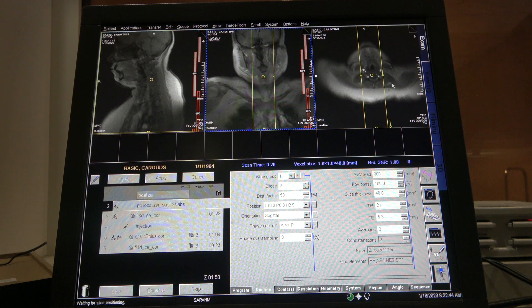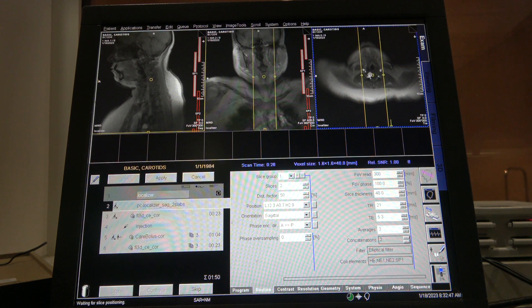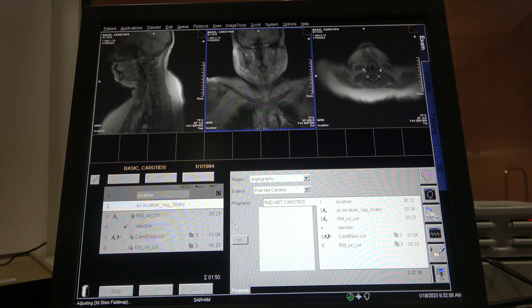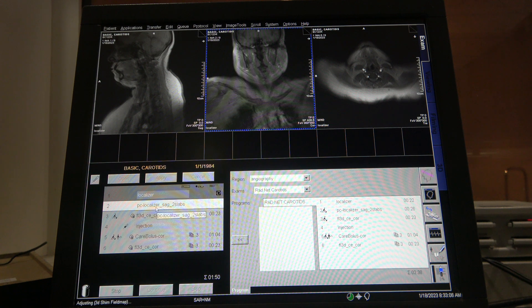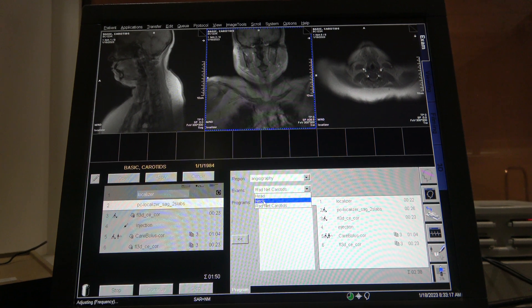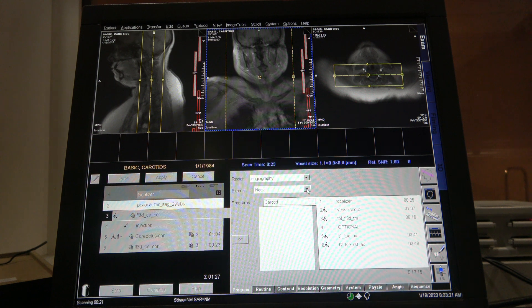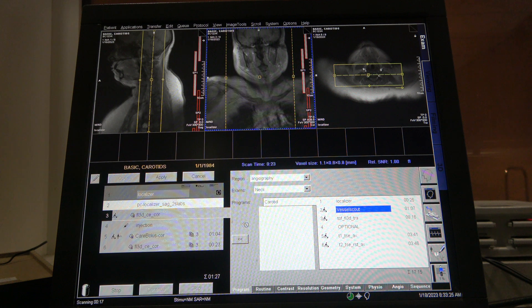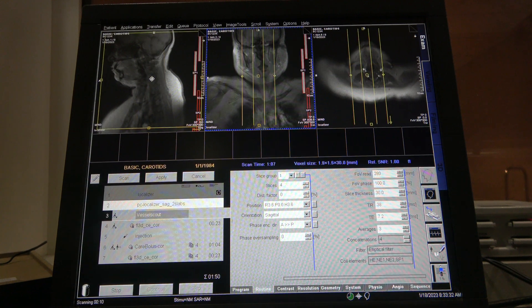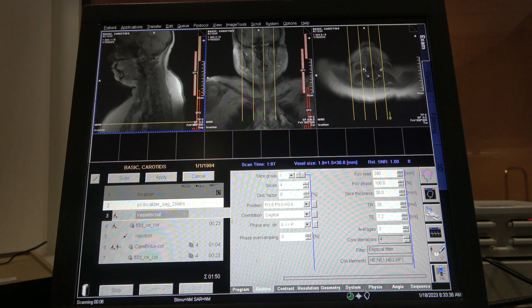First things first, the scouts — you want to make sure you get the carotids in here. I like to use a different localizer whenever you're looking for a sequence that a doctor asks for but it's not in this card. Always look through your other cards and most likely you'll find it. Here's a scout that I like to use.